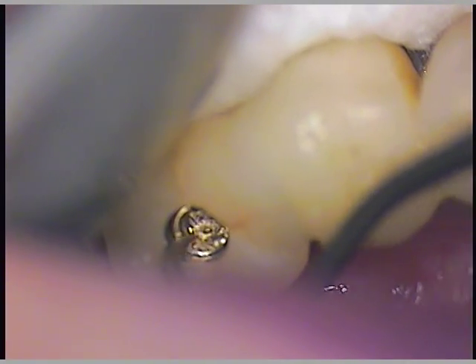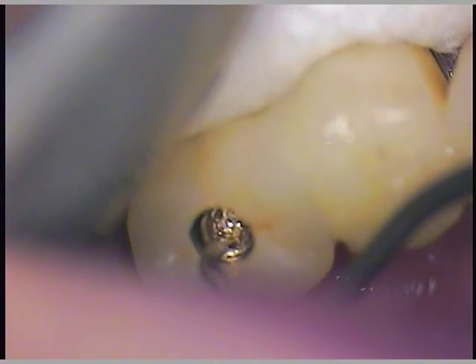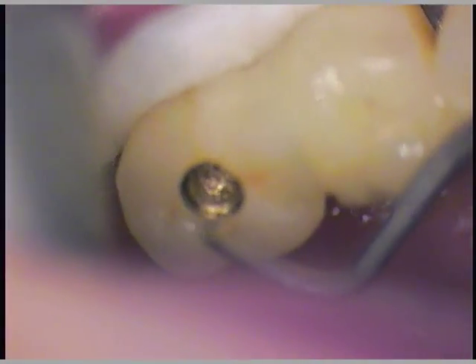There it comes — it just bound it up. So there's probably lots of bio-burden in there, calculus, all kinds of things.